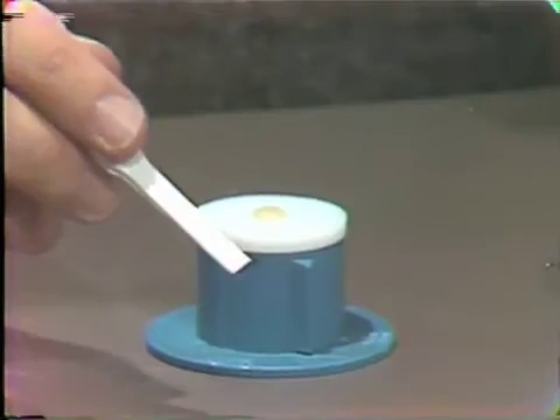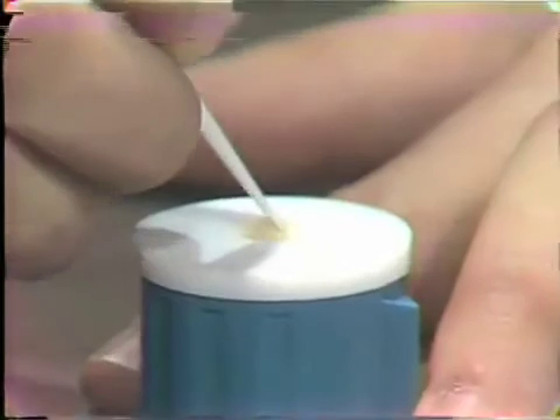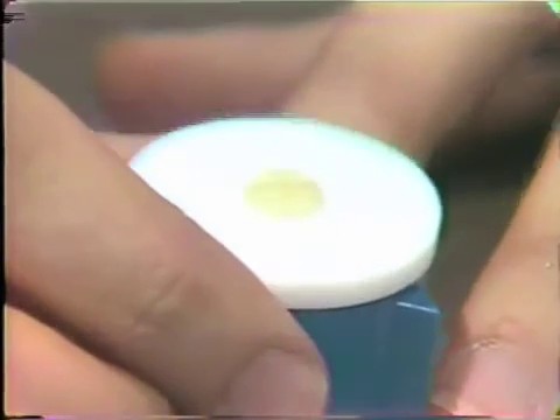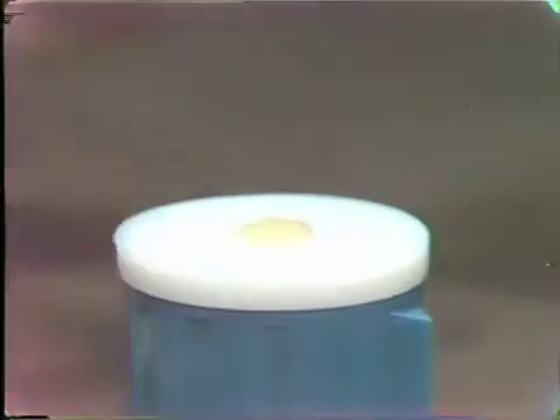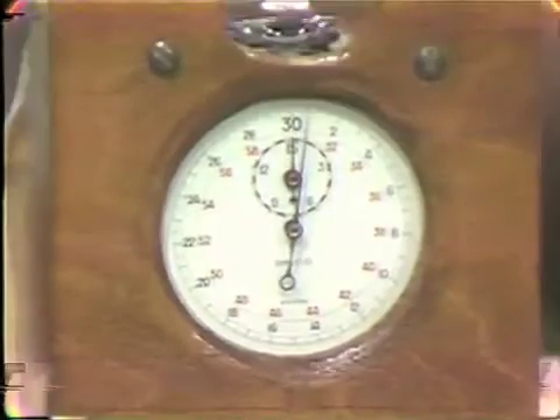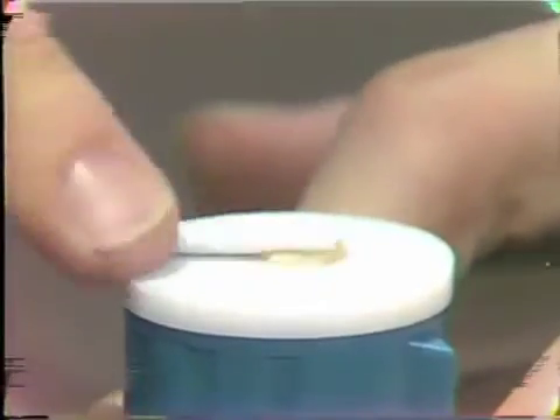The flat end should be used for mixing. This is to help avoid cross contamination. The flat end should be used to make cross hatches in the paste, which will accommodate the liquid catalyst and keep it from rolling on the Teflon surface. The liquid catalyst should be held at a 90-degree angle to the paste and a drop added. This should now be mixed for a minimum of 20 seconds, using a folding action to incorporate the liquid into the paste, making sure all excess catalyst is removed from the Teflon surface.